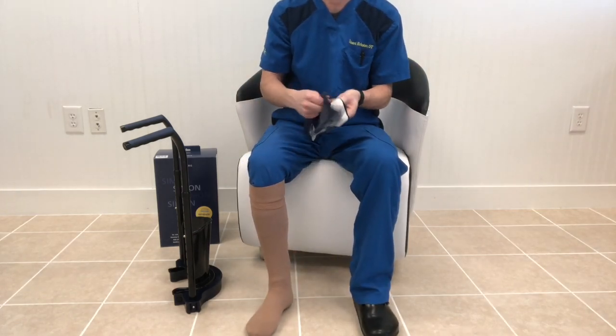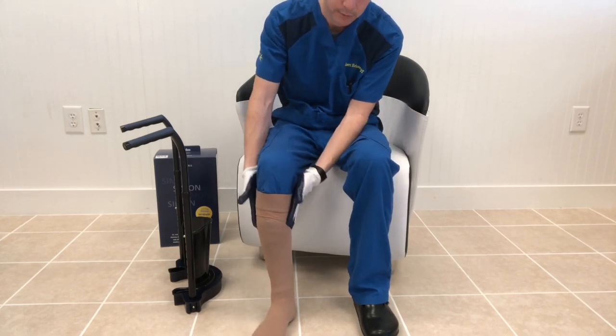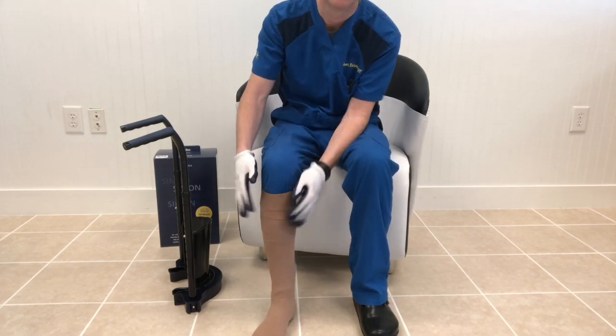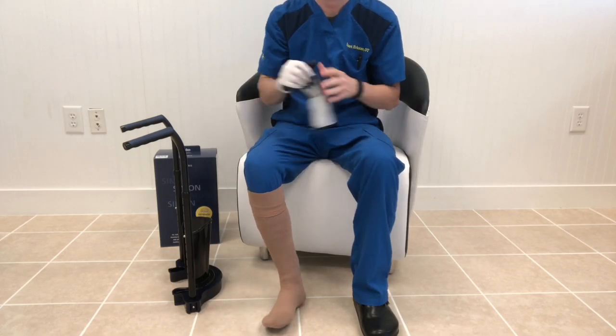At this point, you're probably going to need your rubber gloves again to make some final adjustments. And if you're only able to reach the top part, you can work from there and do some adjustments there. The rubber gloves will help you get better grip on the compression socks.